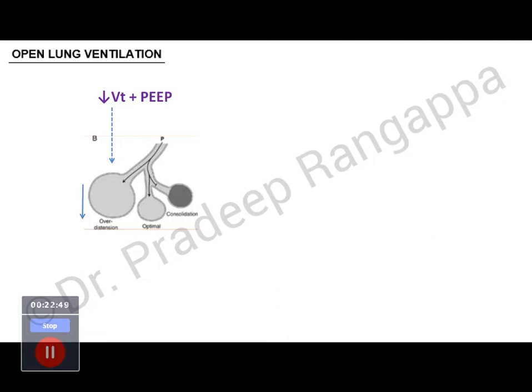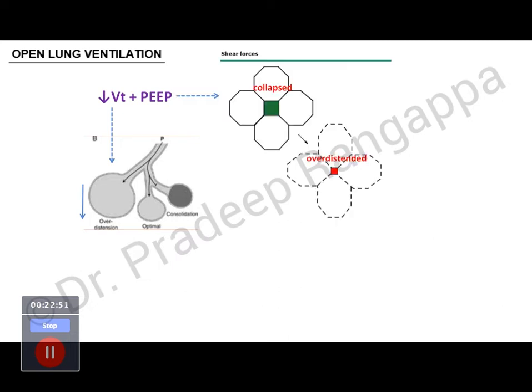So you saw this picture. Low tidal volume helps in reducing the volutrauma, because the low tidal volume we discussed, you want to prevent this over distension and volutrauma. But what about these collapsed alveoli? They would not open up with whatever tweaking of tidal volume. They will only open up with PEEP. So PEEP is given to open up the alveoli, and that is one.